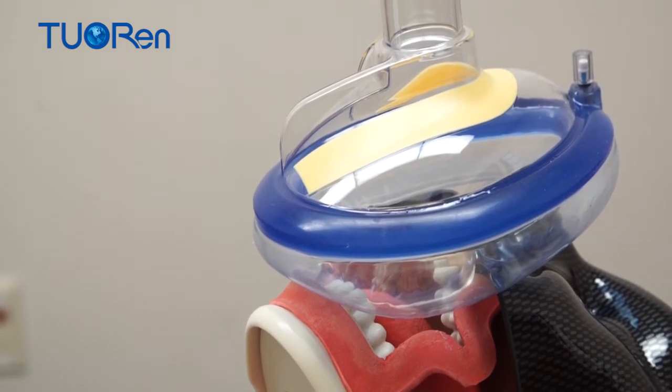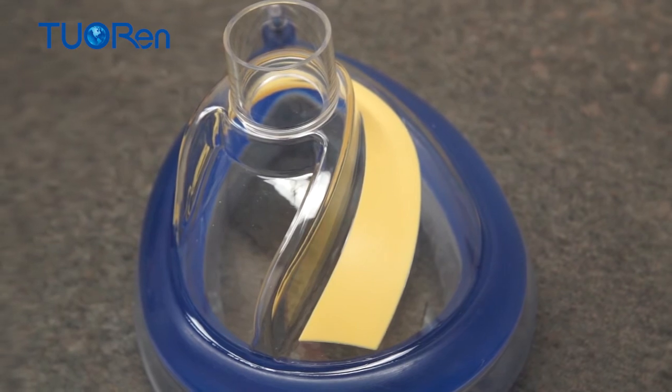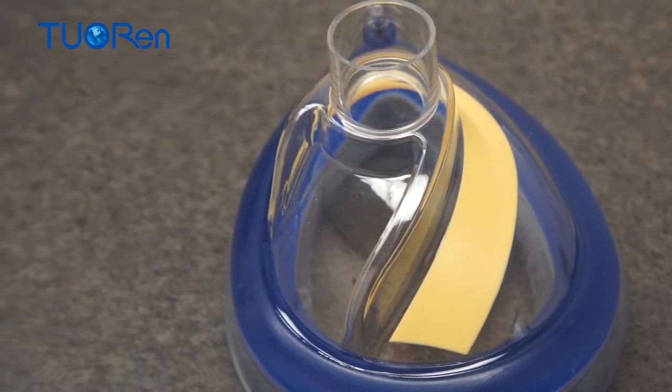The asymmetric ergonomic mask is designed to reinforce an optimal face mask ventilation attempt with an effective seal and a validated chin lift head extension.